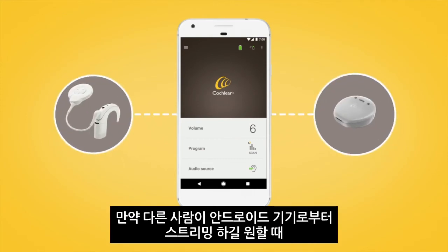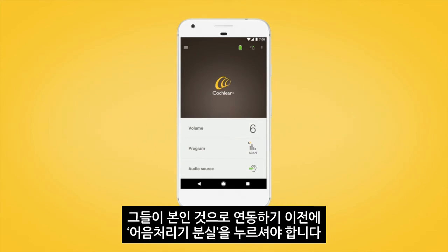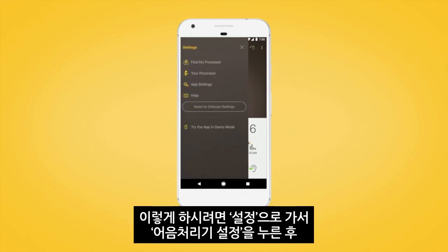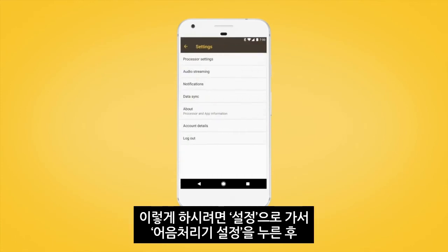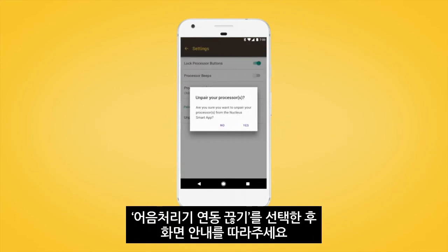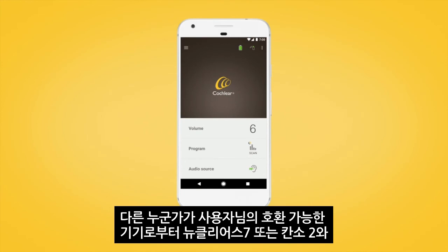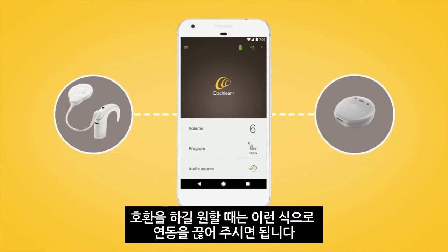If someone else wants to stream from your Android device, you'll need to forget your processors before they're able to pair theirs. To do this, go to Settings and tap Processor Settings. Then tap 'Unpair Your Processors' and follow the screen prompts. You'll need to do this every time someone else wants to pair their Nucleus 7 or Canso 2 sound processor to your compatible device.